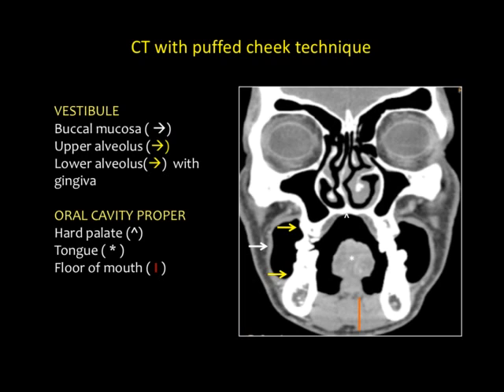So all these points should be kept in mind when you are seeing. The anatomy of that region becomes very important because that would define the extent of disease later on. An edentulous socket, because the tooth is not there within the cavity, gives way for the gingival disease to go into the alveolar socket and lead to mandibular invasion. So these things are very important that you look at that particular site carefully.